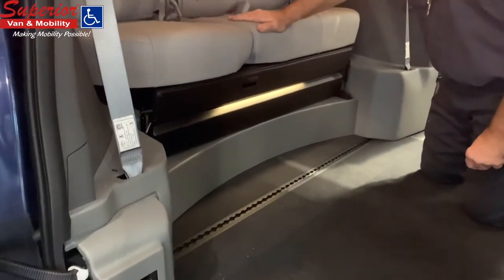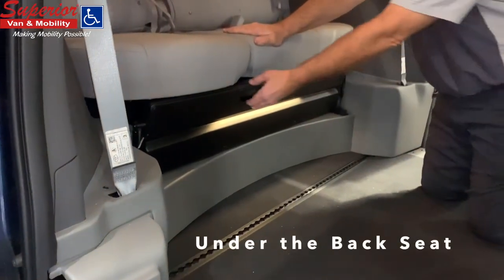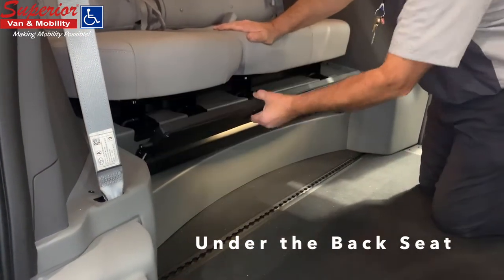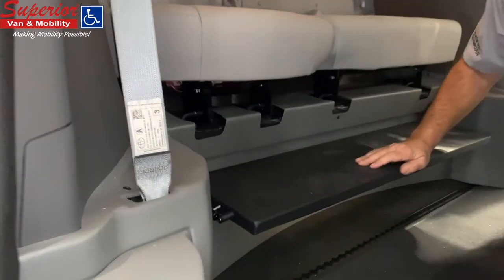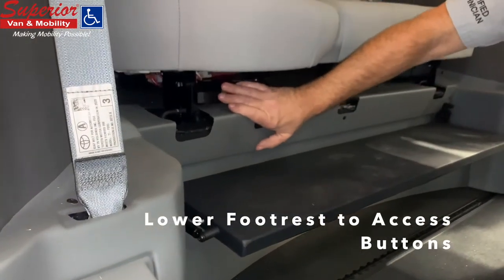The manual override buttons are conveniently located under the back seat within easy reach for a wheelchair user or another passenger. You will need to lower the footrest first in order to access the buttons.